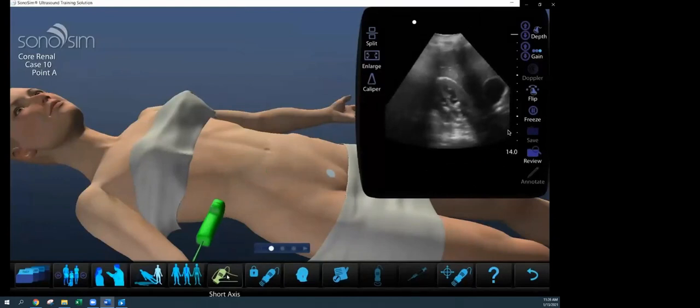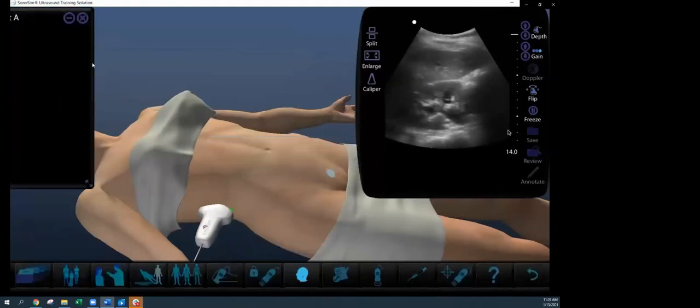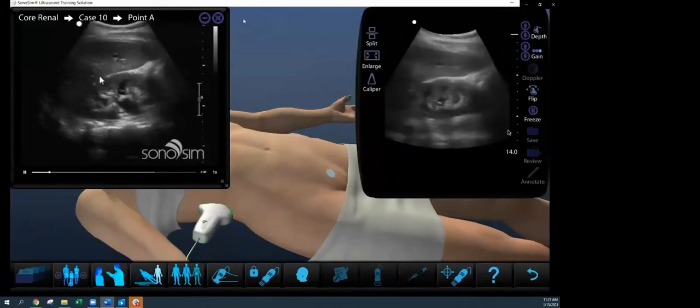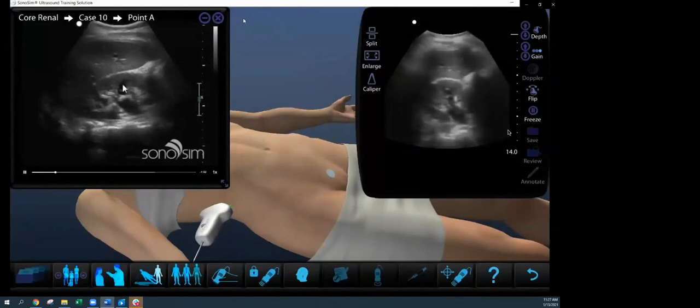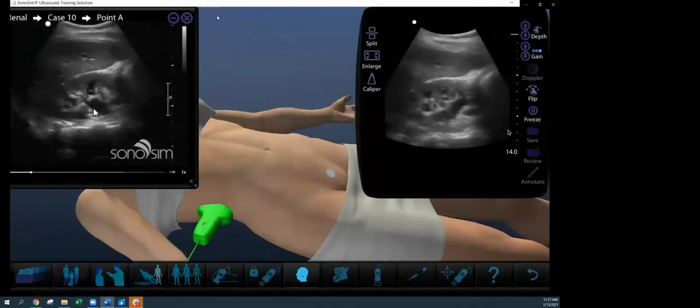In addition to this, you're able to access our findings video. Here you're going to hear an expert narrate the findings as I scan through. A pop-up window appears, and you're going to hear: curved abdominal transducer to scan the right kidney of this 30-year-old female patient who presents with a history of multiple kidney stones, inability to void, allergy to NSAIDs, and right flank pain. We see the liver all around the right kidney, and right away we notice how prominent the collecting system looks. And this is more consistent with a mild to moderate hydronephrosis.